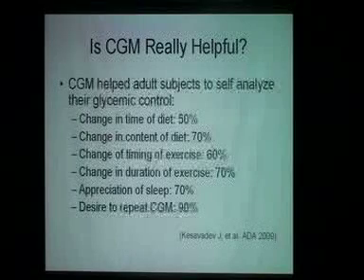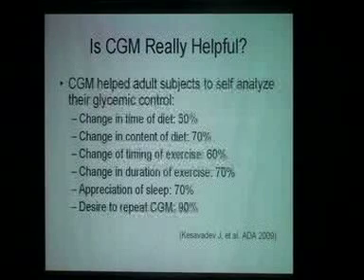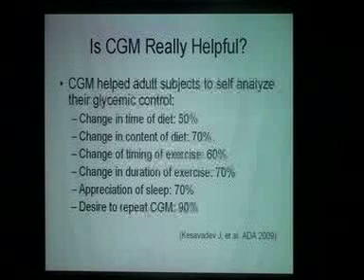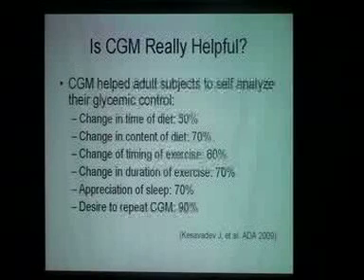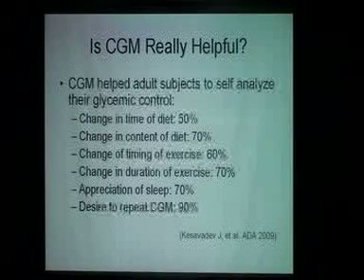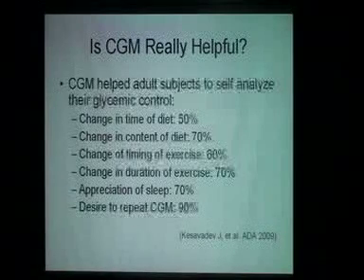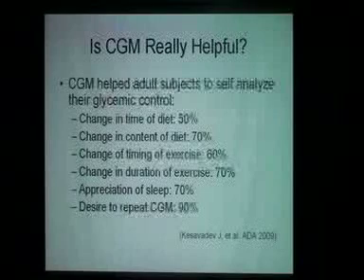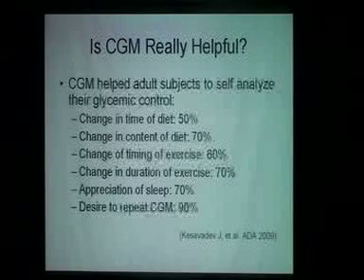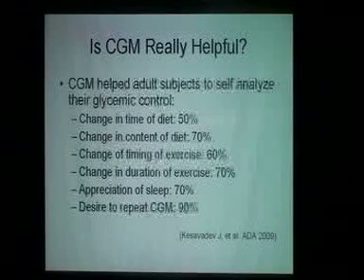In this particular clinical setting, they have a remote device that they can use to send their records directly to the clinician in the hospital, similar to what we have here with CareLink and the internet. And these patients could make adjustments in their insulin dose, as well as get instructions from their providers. And these are the results after only 3 days of use of the CGM.